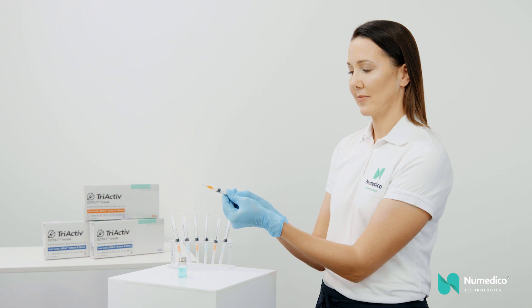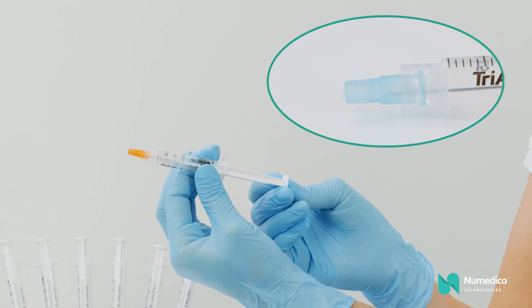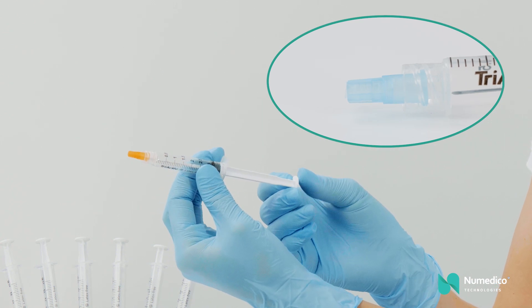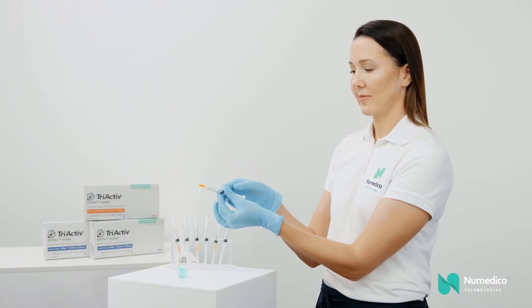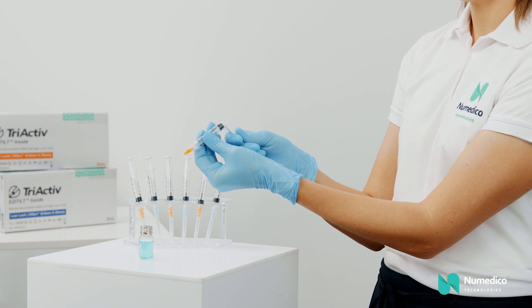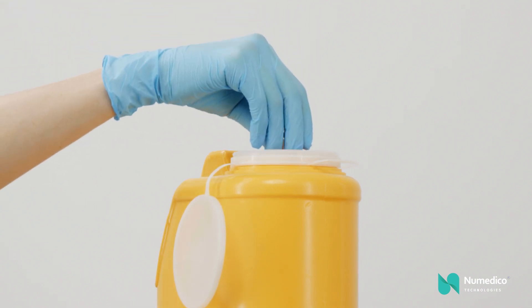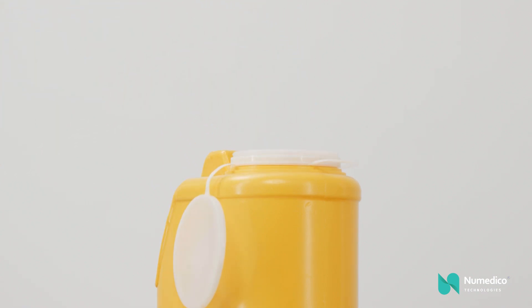Pull the plunger back to retract the needle safely into the barrel. The needle will tilt to one side, encapsulating the needle in the barrel of the syringe. Snap off the plunger at the breaking point to completely disable the syringe. The syringe can then be disposed of as per your organisation's protocols.